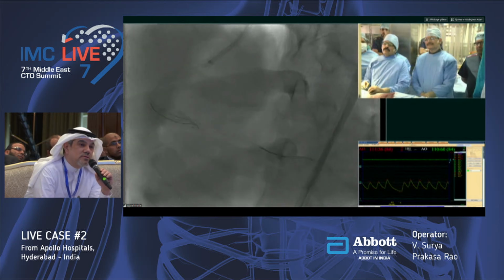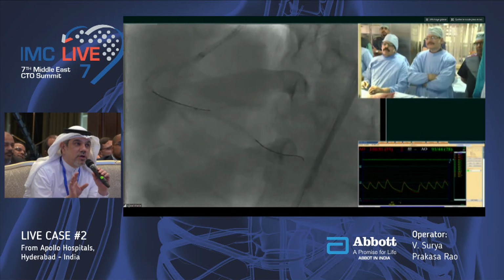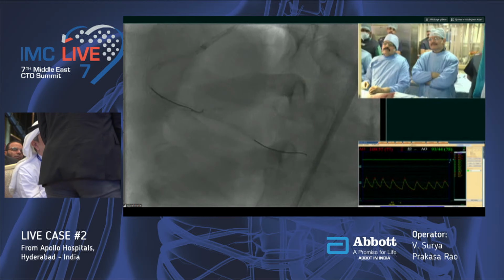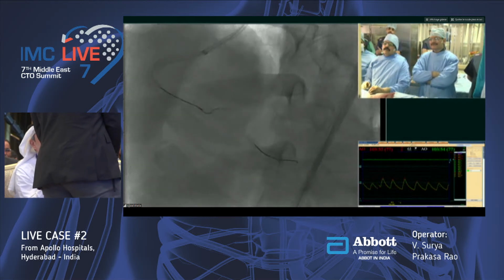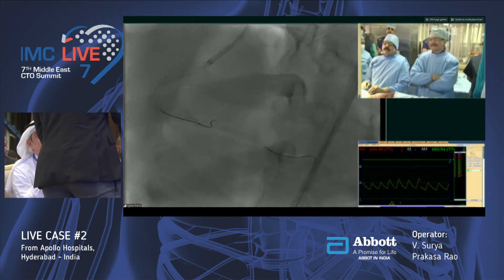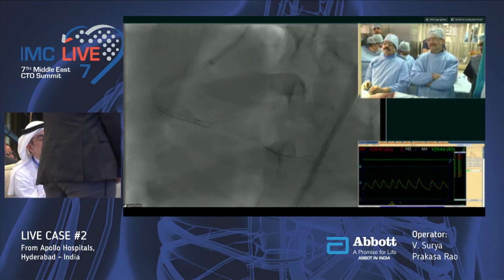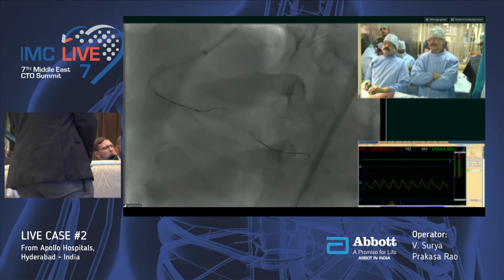So Alex, yes. Yeah, I think we have a great learning case here. First of all, this is a patient who had a previous stenting. So we have a previous angiogram, and we should have seen that previous angiogram. Sure. So we know really how the distal looks and what was the end result before, and so we plan. Proper planning for the case is the key to success.